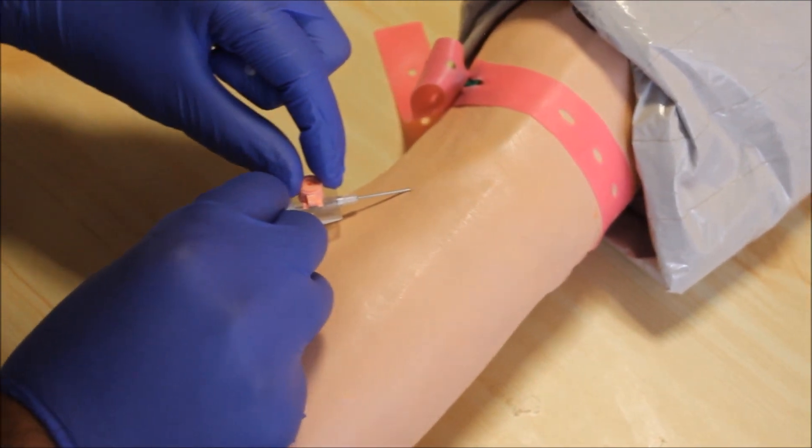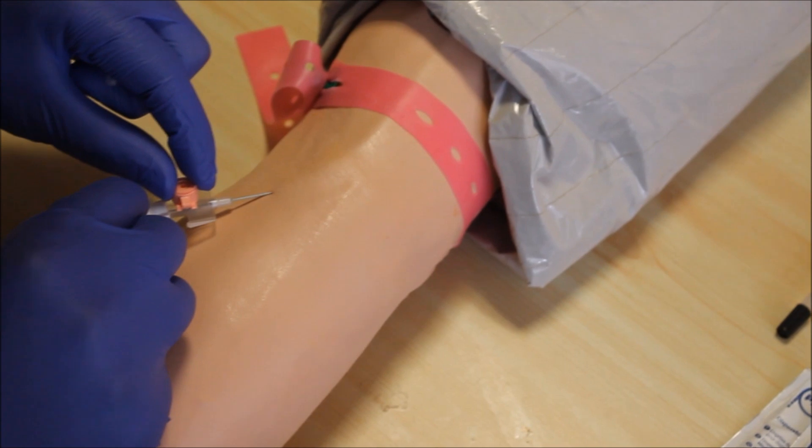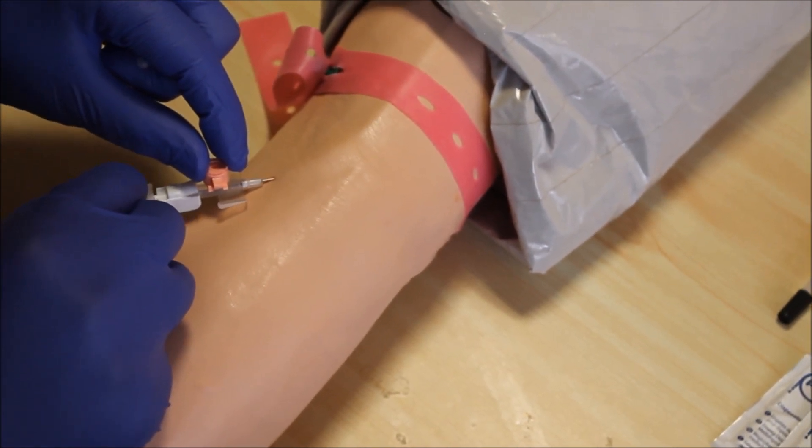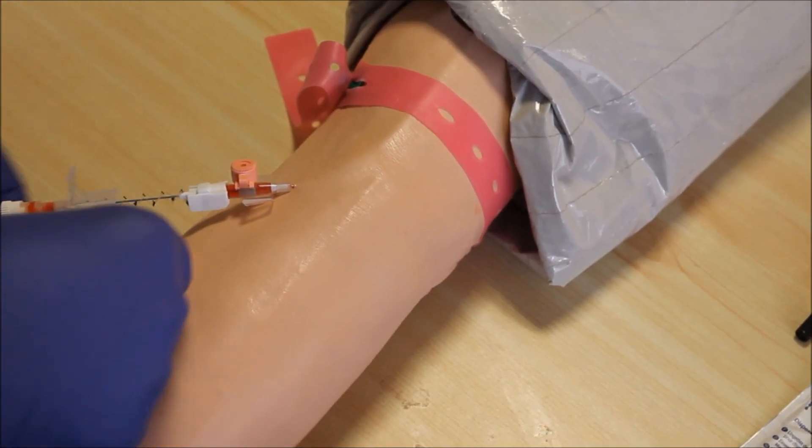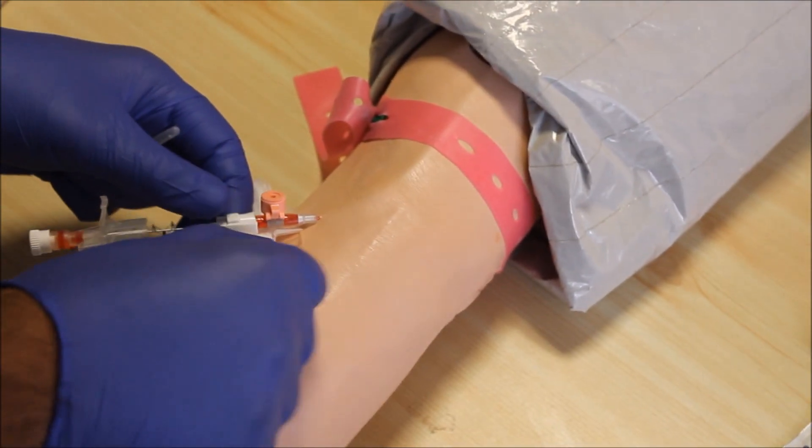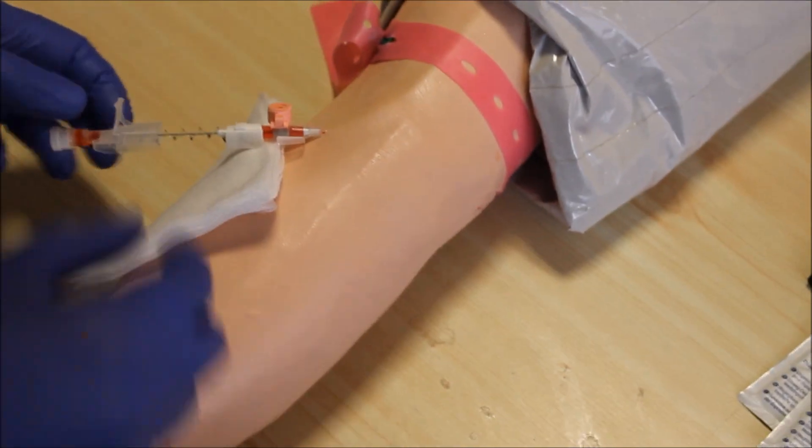After that, move the cannula very nicely in and keep a hold of the needle. Make sure to place your gauze under the patient's arm to not make a mess with blood.